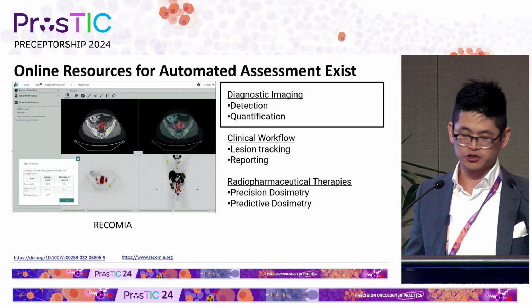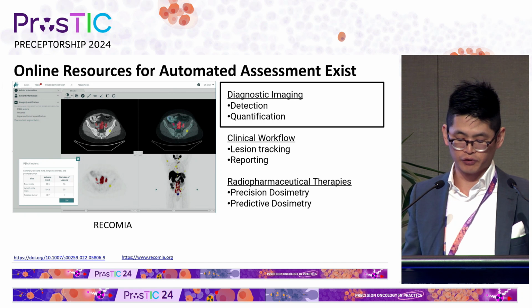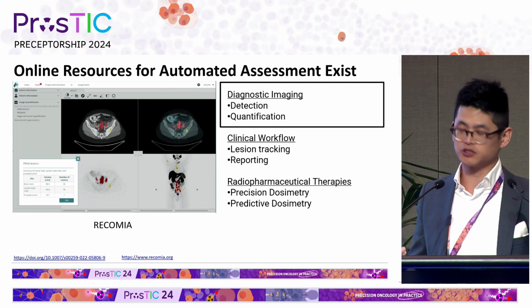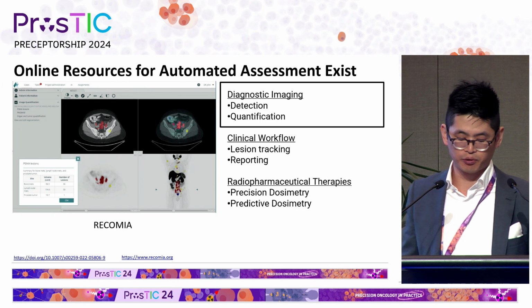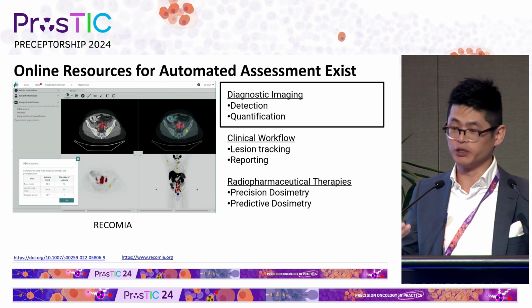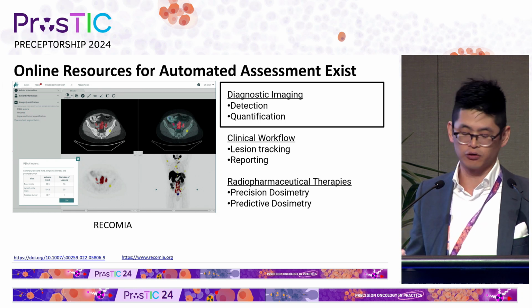So, there are other solutions. There's a more open and free solution by the Scandinavian group called RECOMIA. This can be accessed with request. And this one focused just on pelvic node detection and achieved better, with around 1.8 false positives per patient. That seems lower, but actually when you looked at the difference between doctors, the false positive rate was 0.3. So that's really the practical number to beat.